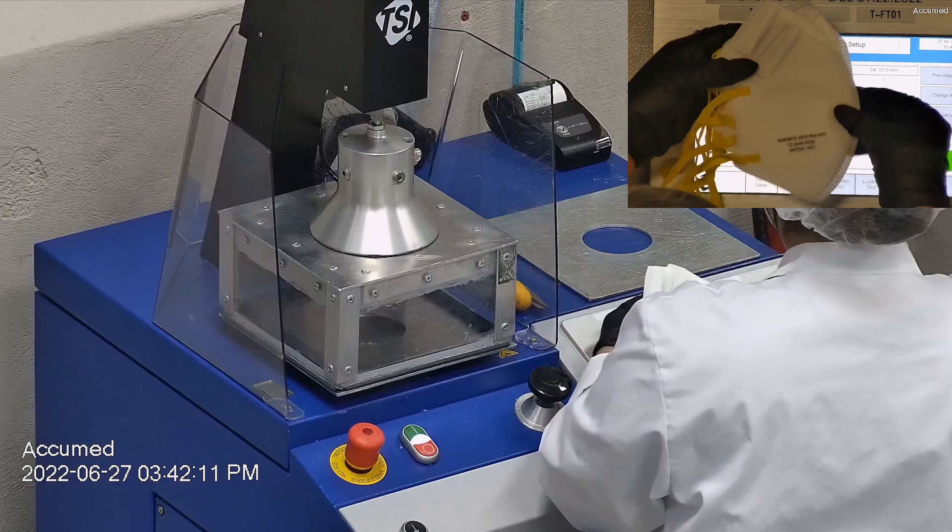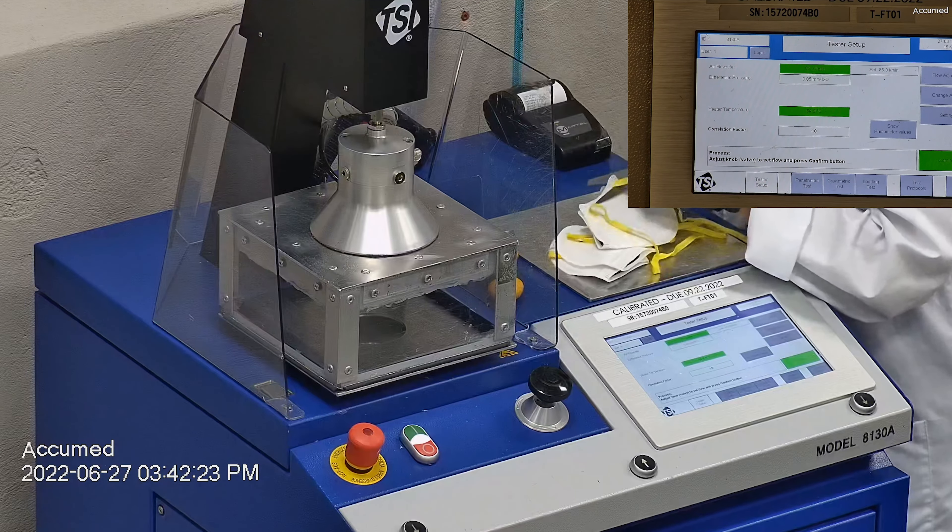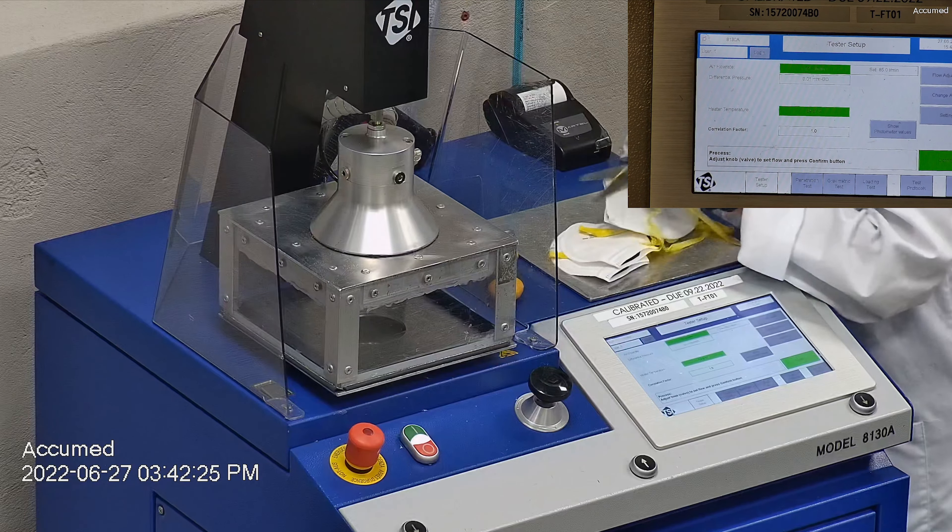So with that being said, let's go ahead and see how these test on our TSI machine. We're going to be testing both the filtration efficiency and the pressure drop. This is our TSI machine 8130A, which is also the same filtration testing machine that NIOSH uses to approve N95 respirators.